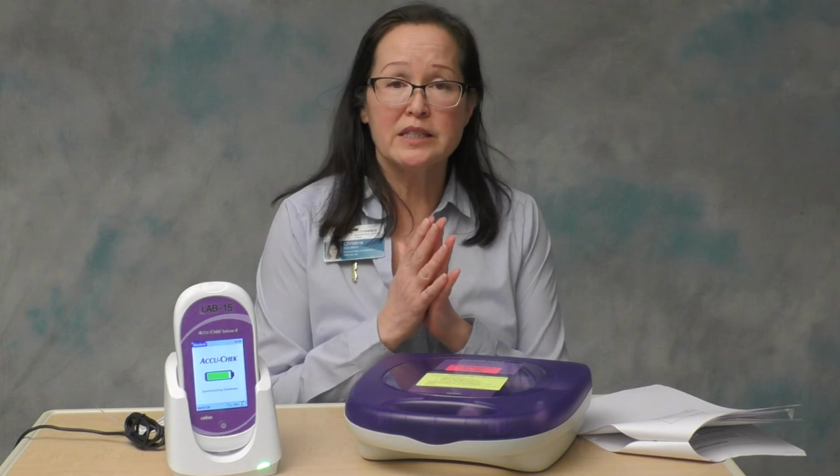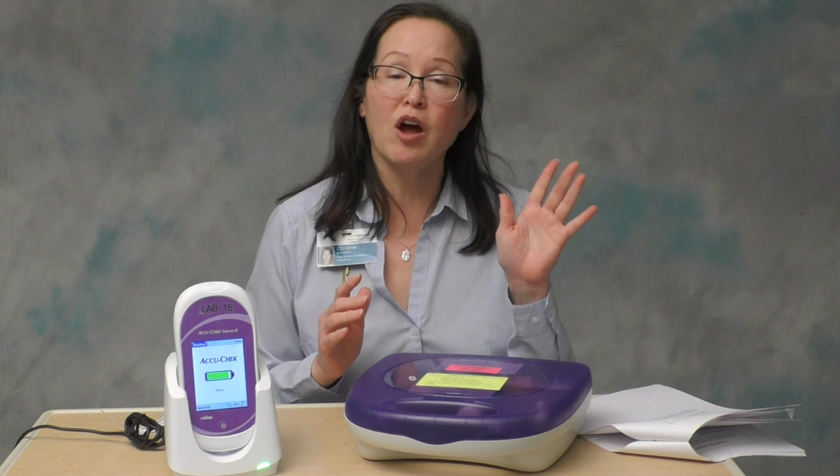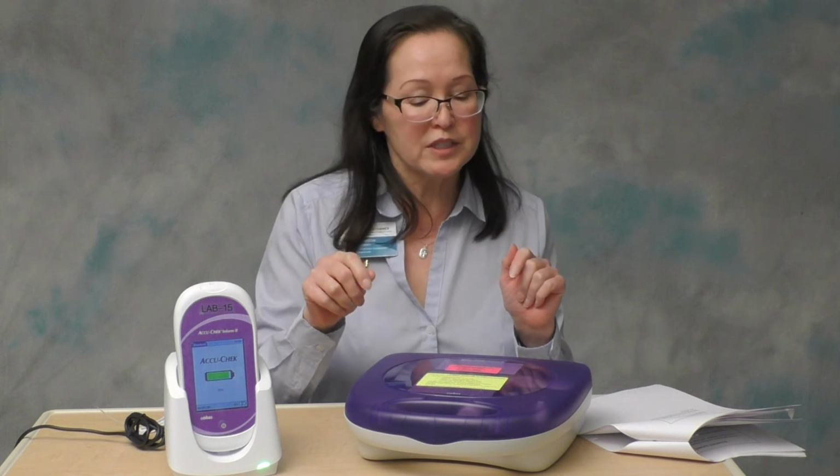So for patient testing here, we train to preferentially use the third or fourth finger of the non-dominant hand. Then you could use the third or fourth finger of the dominant hand. You can use the fifth finger if it's not too small. You want to avoid the thumbs because they have a pulse of their own. Avoid the second finger because it has more nerve endings and it'll hurt a little bit more afterwards.